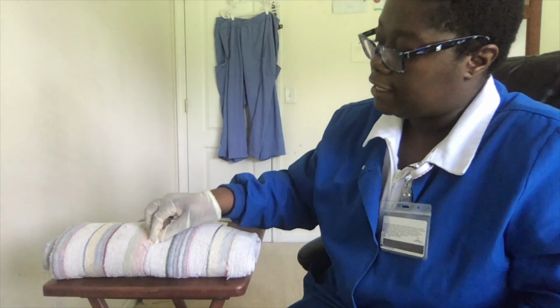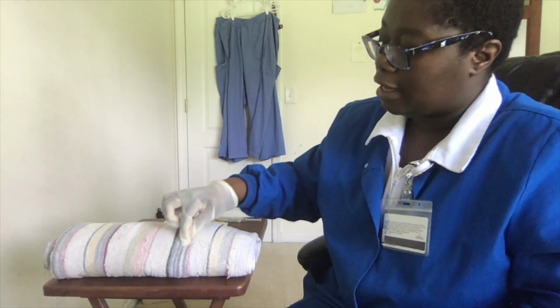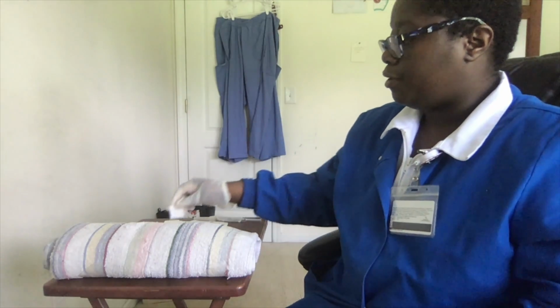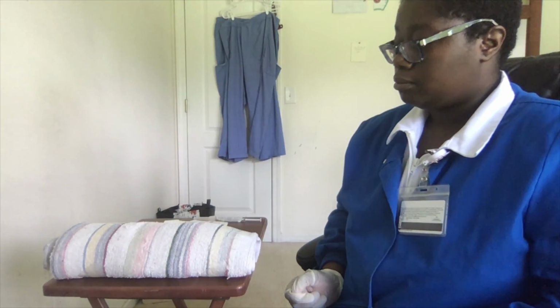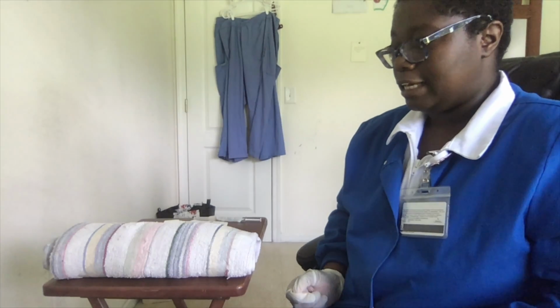And now I'm going to clean the area. I'm going to verbalize that I've let the area completely air dry before continuing. Are you ready, Anna? I promise it's only going to be a slight pinch.